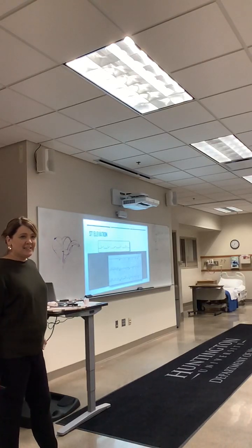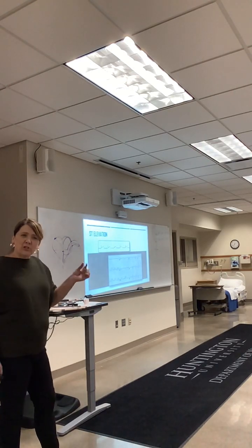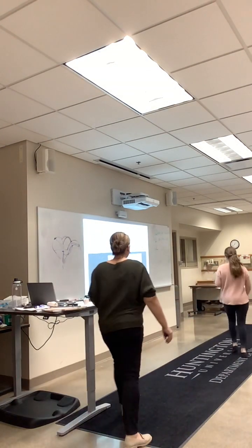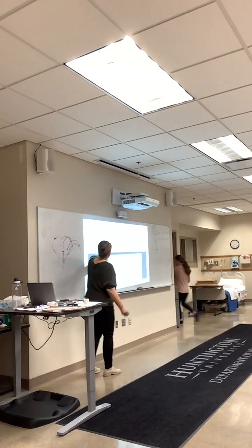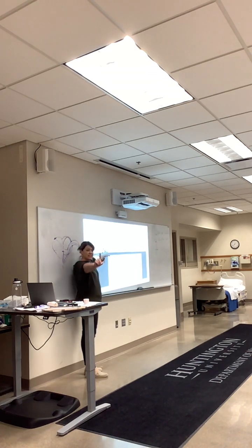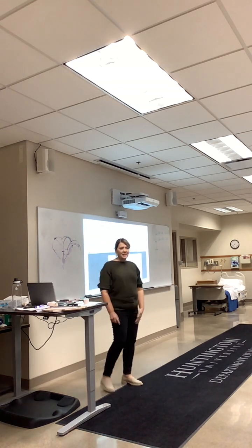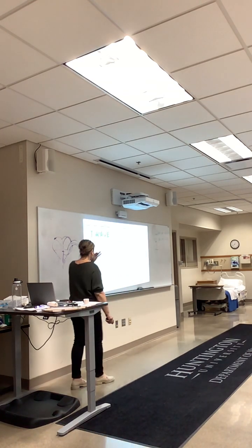To relax. With a little Q wave divot, you mean? With the S, yeah. It affects the flow through the heart. Whenever it falls down too low, that means ischemia. When it goes up, that means you have an infarct. We have actual injury going on. We'll get into that. I don't want to get into that right now.